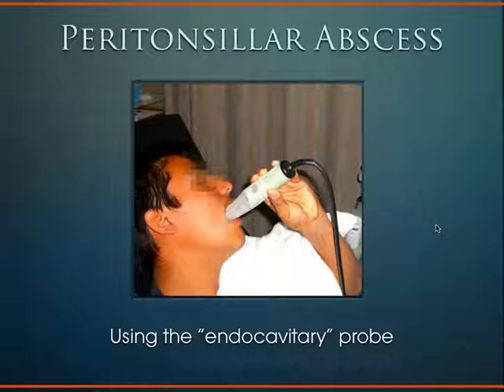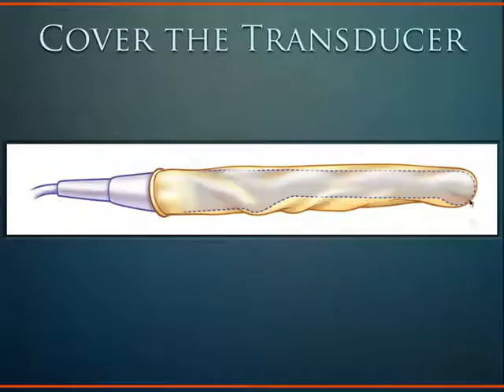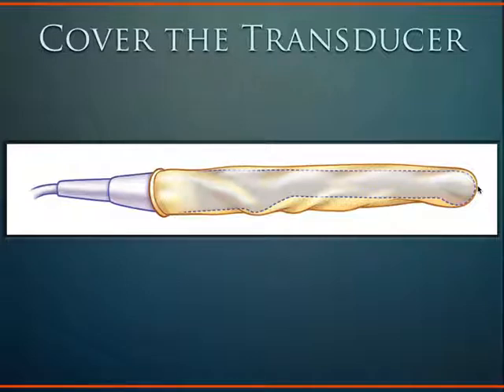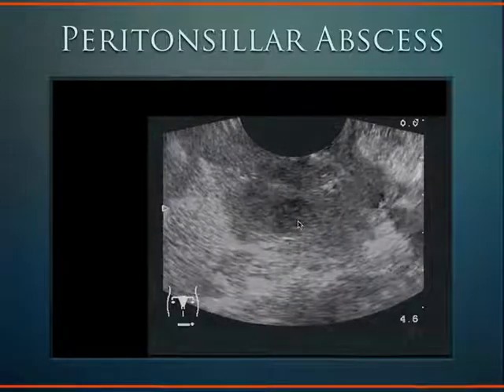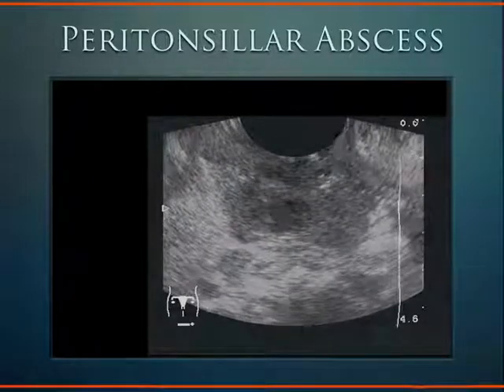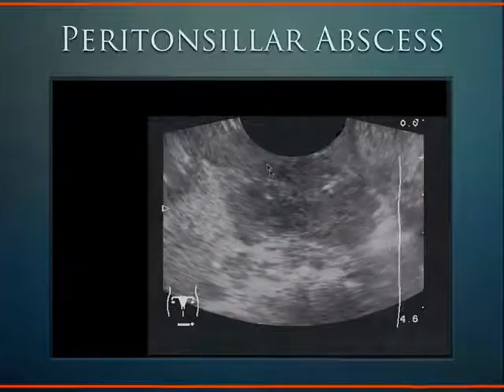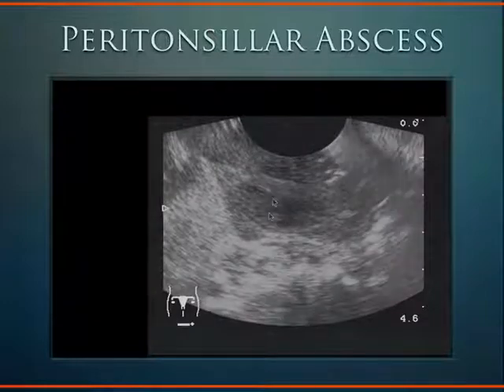Keep the transducer as clean as possible using a sheath, with gel between the probe and the sheath. You can spray the back of the patient's throat with an analgesic spray like benzocaine or hurricane spray, and a little versed to calm the patient's nerves. The tonsillar abscess looks like this — the endocavitary probe's footprint is back here, and the needle was guided directly into the abscess. This hypoechoic area here is the abscess.